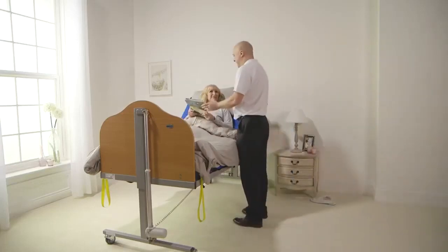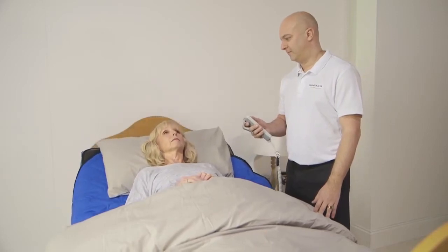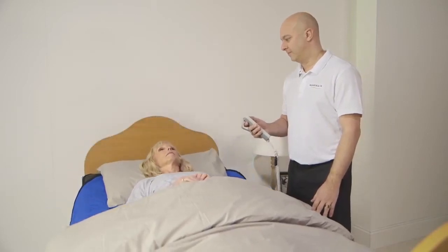Welcome to our short video, which shows how a single carer can turn and support a person in bed using the freeway bed management system and body support wedge.